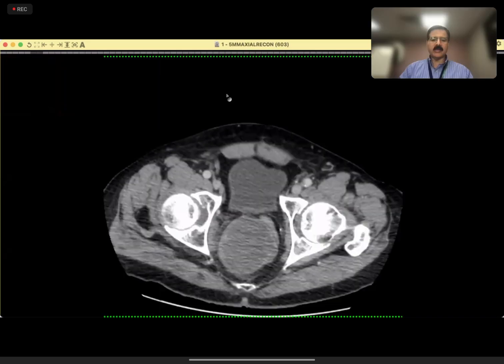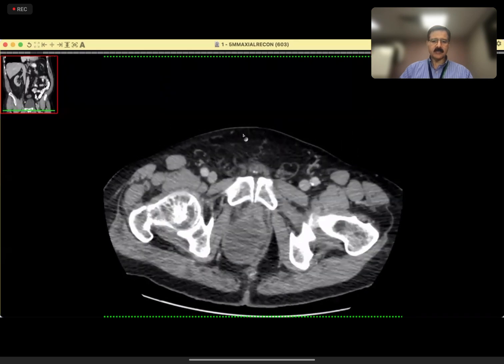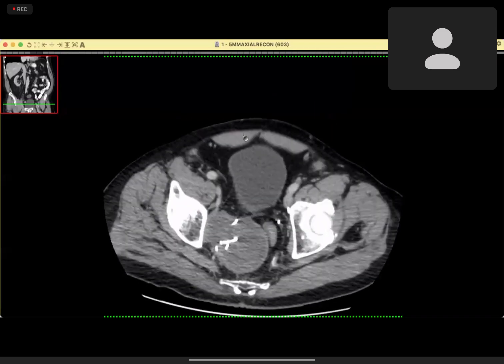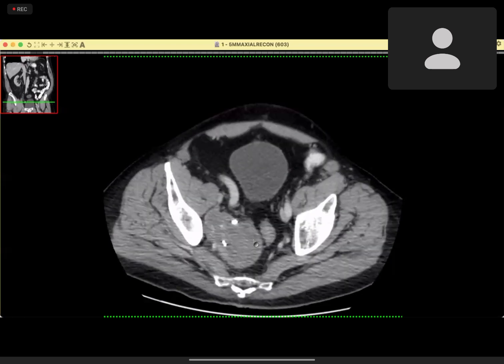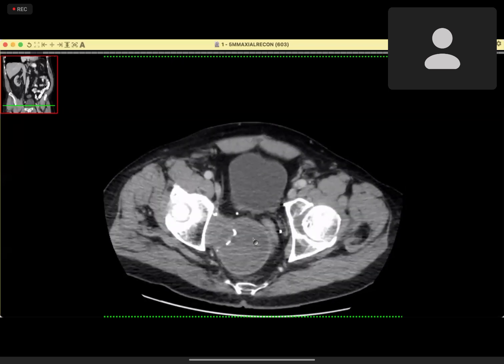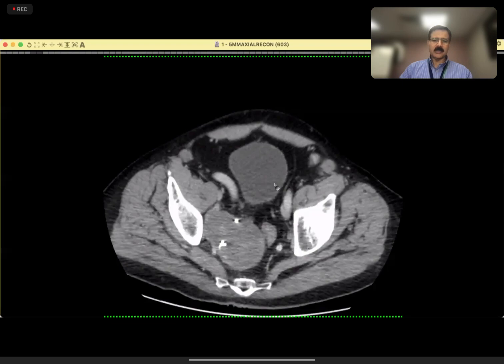Okay, we did a CT for this patient. This is the CT finding. There is calcification inside the lesion. The density was quite high. It was sort of a metallic type of density. Does the patient have any history of surgery? If the patient has any history of surgery, this is maybe a metastatic recurrence from prostatic cancer after removal of the prostate. Okay, madam. Thank you.